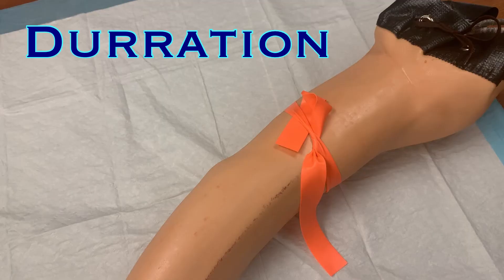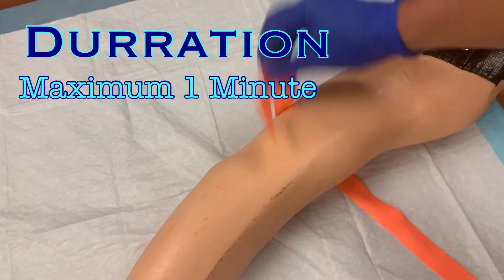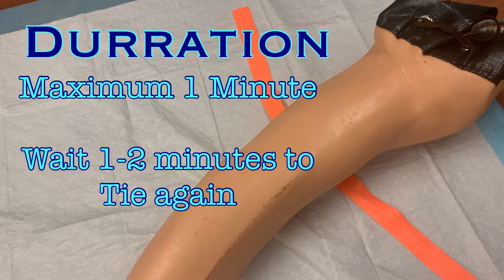A tourniquet should only be in place for one minute or less. If after a minute you have not located a vessel, untie the tourniquet. You can check the other arm at this point, or wait one to two minutes before retying the tourniquet to continue looking on that arm.